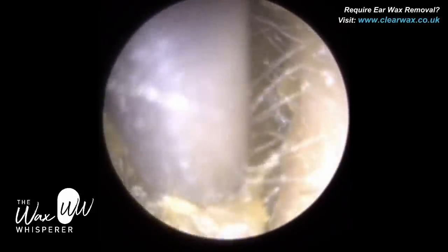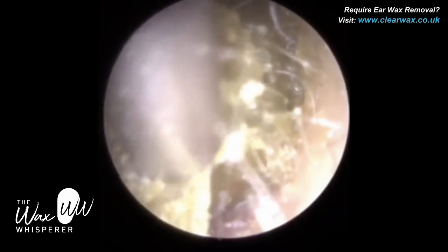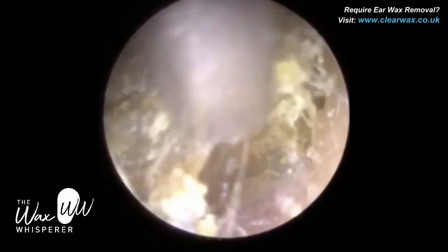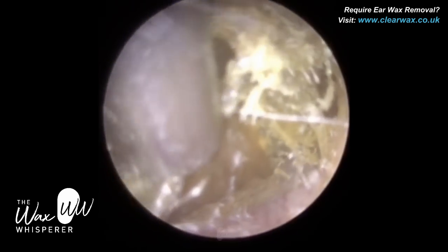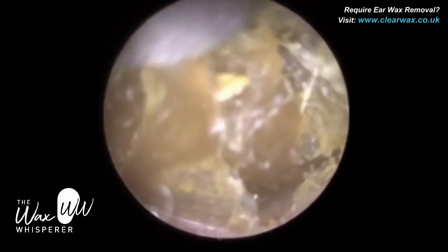Again, we're quite lateral near the entrance. This wax is quite stodgy and mushy. Once more, I'm just trying to lift the wax off the canal wall. Ear wax quite often adheres to the ear canal walls. By loosening and breaking these adhesions, it mobilizes the plug of wax and then enables you to remove it from the ear.